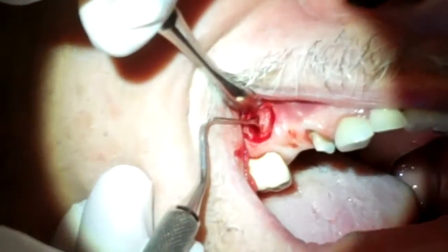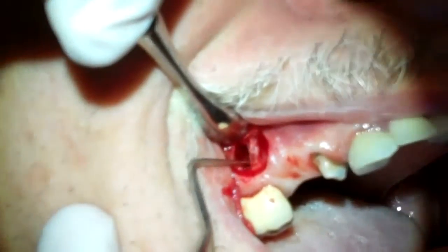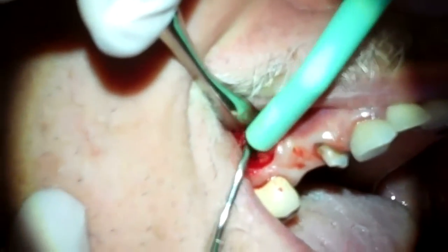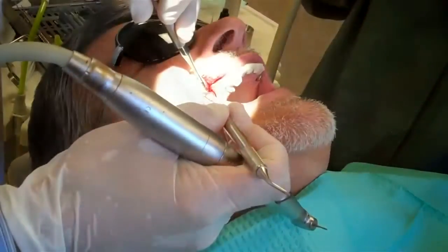This is the area right in here in the root. There are 3 roots on this tooth, and this root comes down in here. As I clean out the infection, it will expose the root a little bit better. I want to clean all this infection out and see how that's going from there.